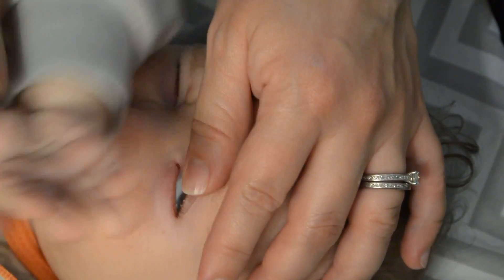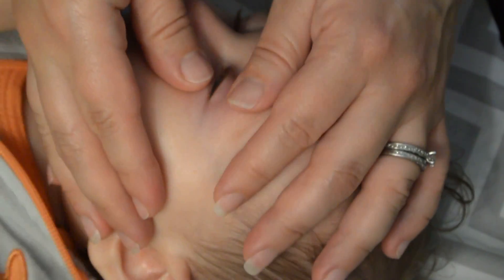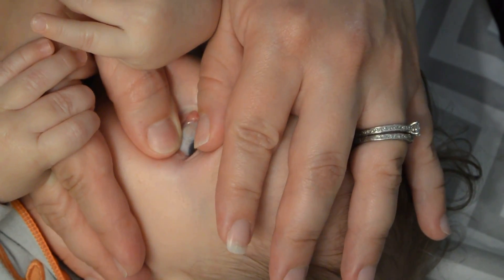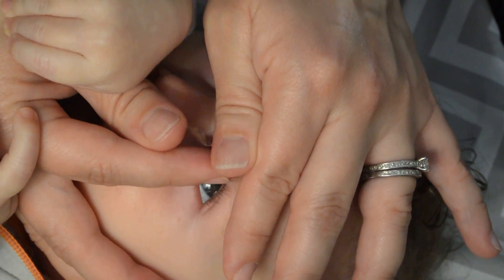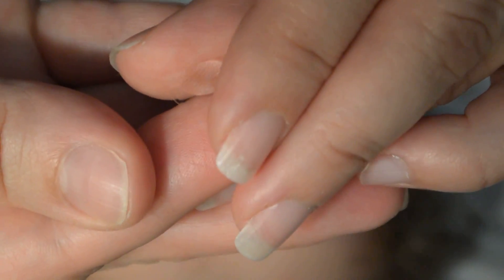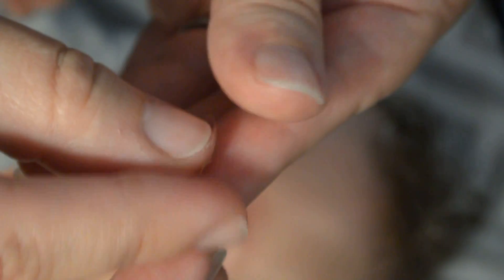He currently has a 32 diopter in his eye and we are switching down to a 19. You can see me push down and pulling together — and I got it between my fingers there. And as you can see, here is the contact lens. And he is not too upset. Here is the lens.